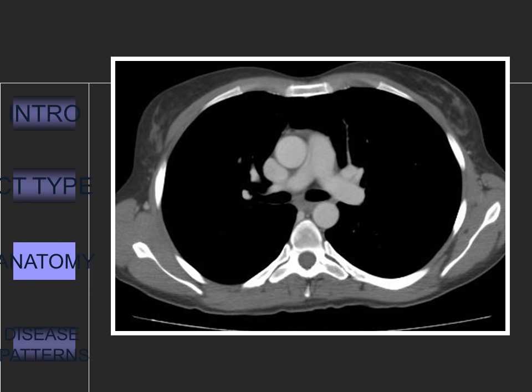Now see which structures you can identify. The width of the main pulmonary artery should be less than three centimeters. If it is more, then it is likely that the patient has pulmonary hypertension.